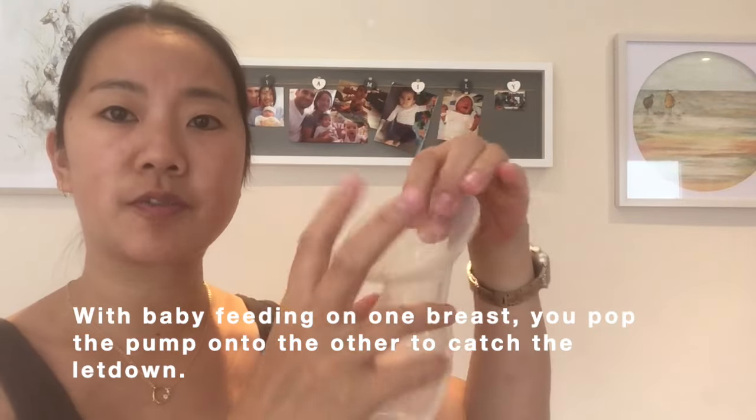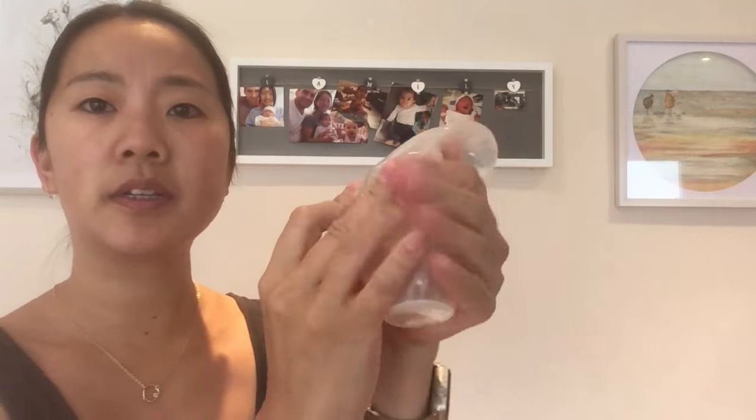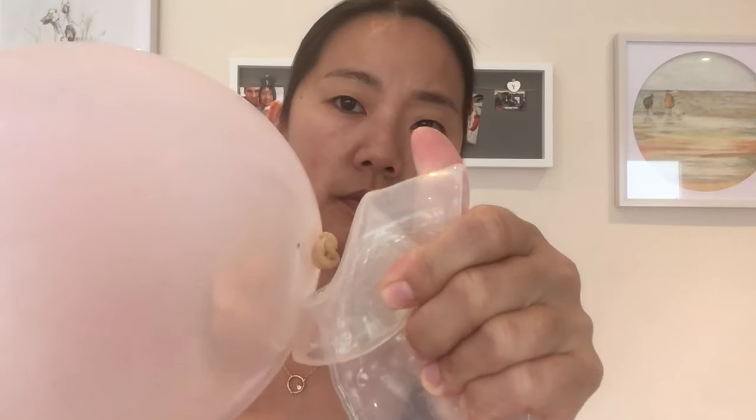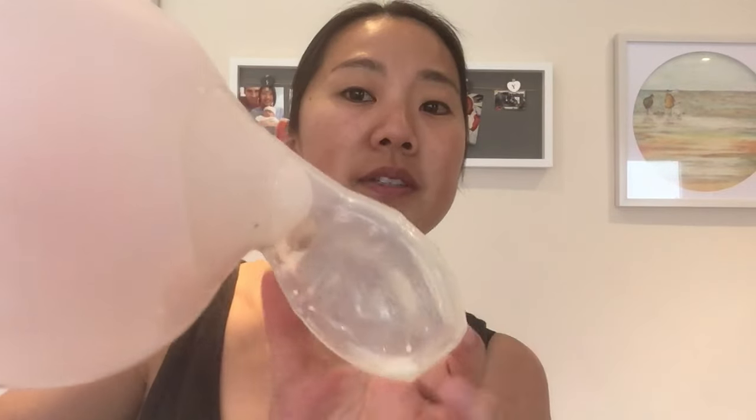What you do is flip the flange back, put it in your hands, squeeze out all the air, and then put it onto your nipple. Make sure it is centered around the flange, then push the flange back so your nipple is suctioned in. All the letdown milk will be collected, and as it's collecting, you can continuously squeeze out the air so there will be a continuous suction.